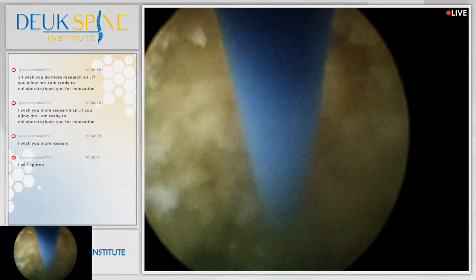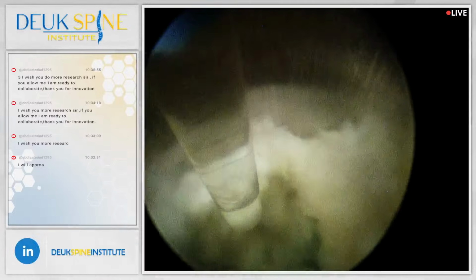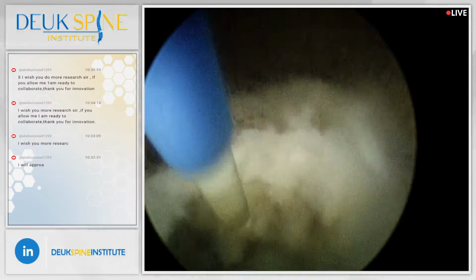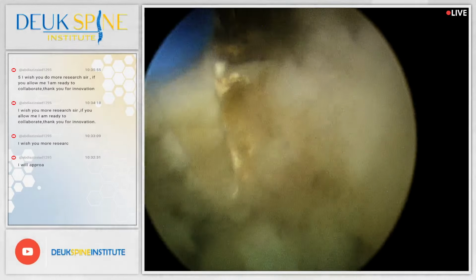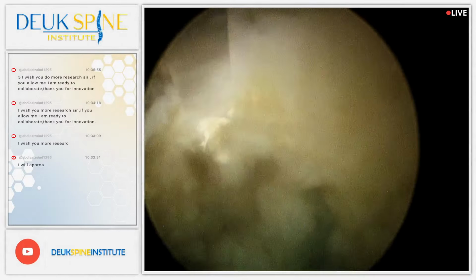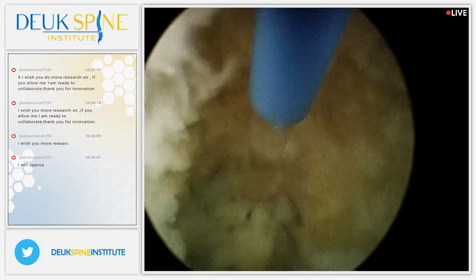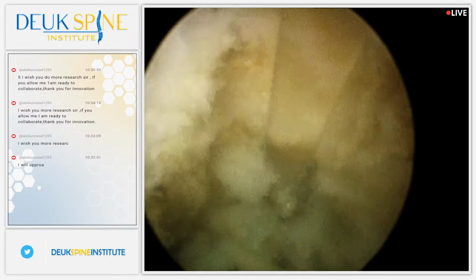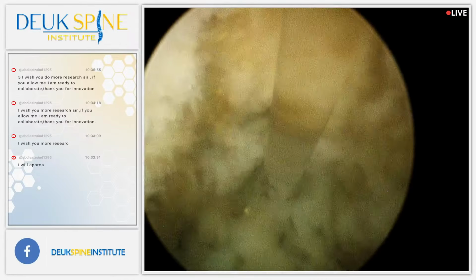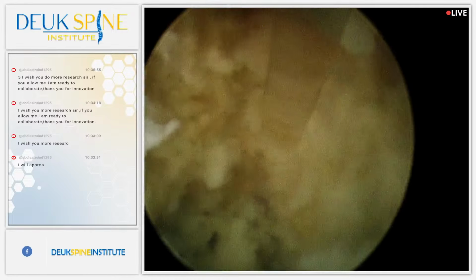Dilator to get down to the herniation. It's a metal stick with a tapered tip. It spreads the muscles and soft tissues apart so we can get down here using a tube. And the tube itself is 7 millimeters wide, 1/4 inch. So we're not making a very big passage, we're making a very narrow passage. This is what's called ultra minimally invasive spine surgery.